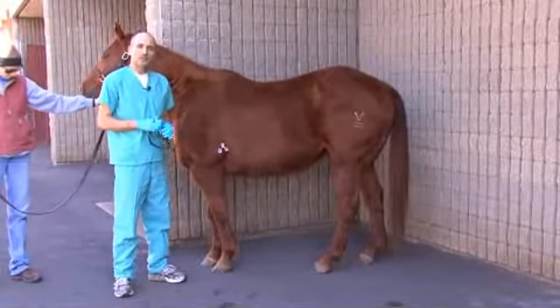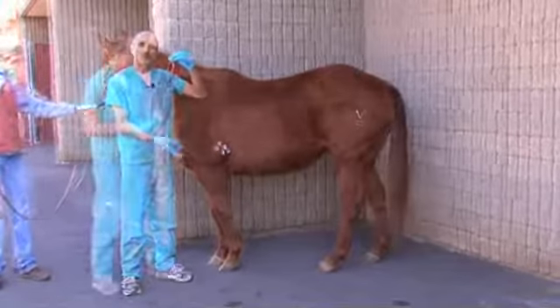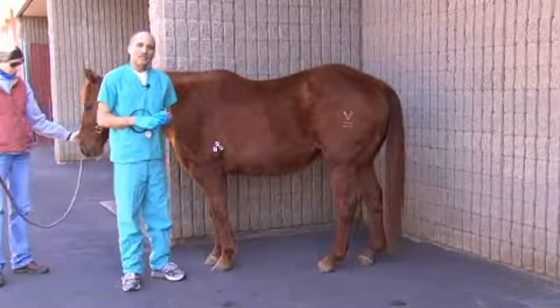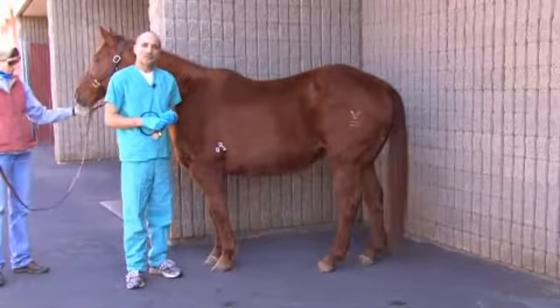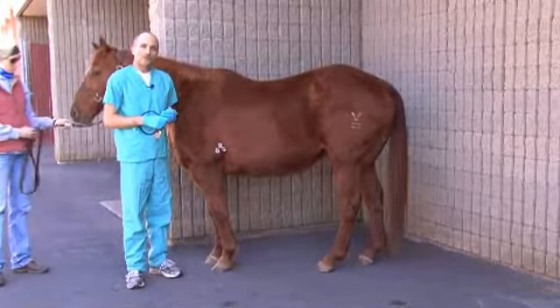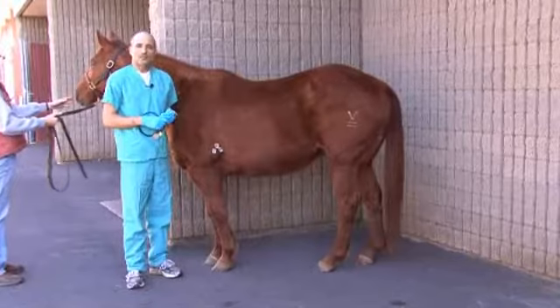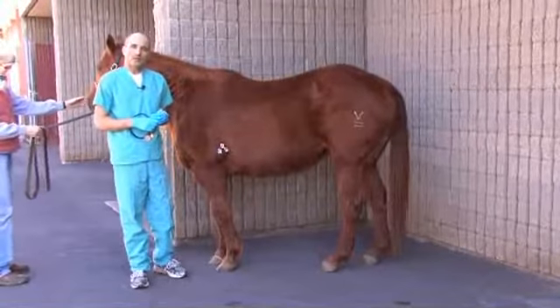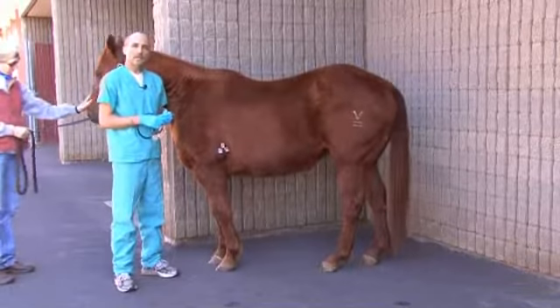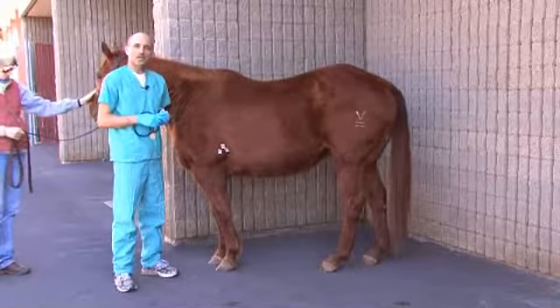Next is the equipment used to perform auscultation of the heart, and that is a basic stethoscope. Third is to review the different heart sounds that horses' hearts make. The basic heart sounds are called S1 and S2, and those sound like a lub and dub when you're listening to the horse's heart. It's also normal to hear two additional heart sounds in horses. Those are called S3 and S4. They're usually not as loud in intensity, and normal horses can have anywhere from 2, the S1 and S2, or as many as 4, S1, S2, S3, and S4.